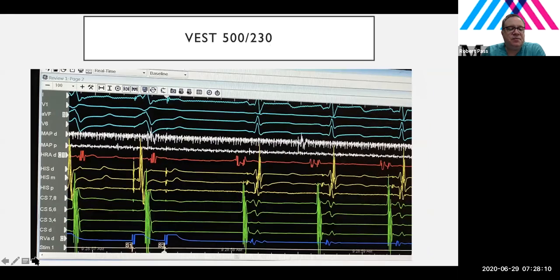And so one of the things that we learned in that paper was that the most consistent, so there are two ways to really map this, right? One would be to induce tachycardia and map in tachycardia, right? Because in tachycardia, you go down the AV node and then up the accessory pathway. And so you could map the VA interval in tachycardia. But when patients are in tachycardia, the heart is beating very rapidly, and it can be difficult to maintain good catheter stability at that point.